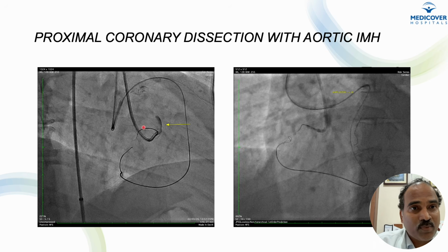You can see in this process we noticed an aortic dissection here, so you can see contrast visualized in the aortic wall, and that's when I had to change my Amplatz guide to a JR. You can see this is the JR guide, which came in place of the Amplatz to avoid further dissection expansion and creating problems to the aorta. And we also brought a guide extension. I think this is mostly a Trapliner, and then a microcatheter and a wire.